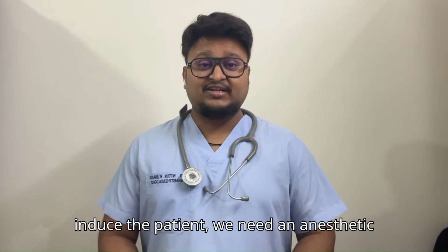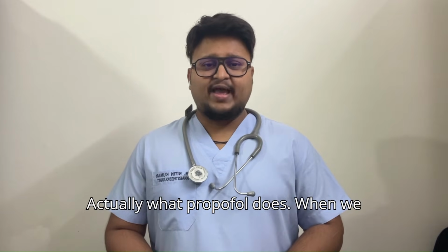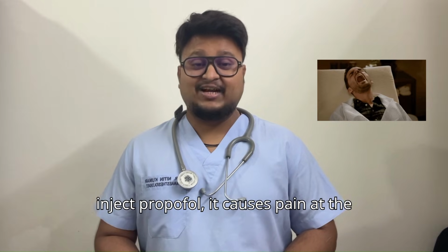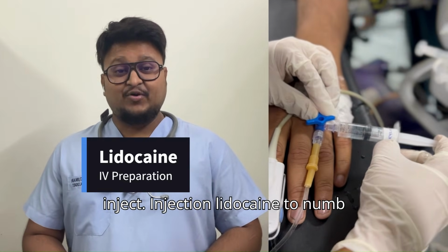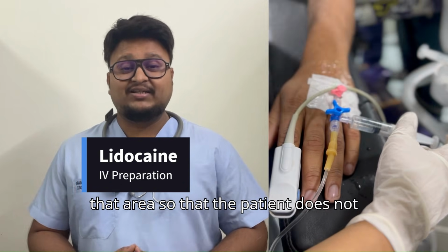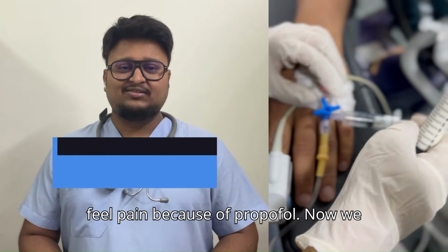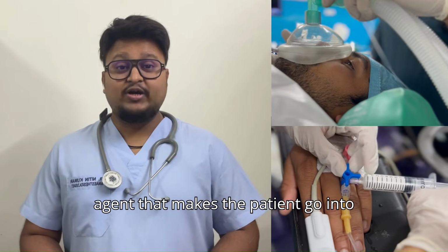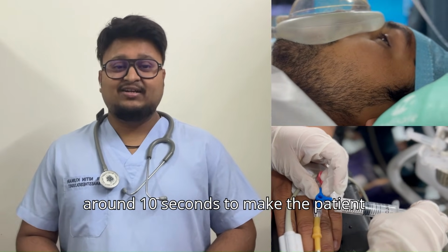Now to induce the patient, we need an anesthetic agent. Here we'll use propofol. Actually what propofol does, when we inject propofol, it causes pain at the site of injection. So what we do, we inject injection lidocaine to numb that area so that the patient does not feel pain because of propofol. Now we give propofol. Propofol is a fast acting agent that makes the patient go into apnea very fast, within seconds. It takes around 10 seconds to make the patient go into apnea.